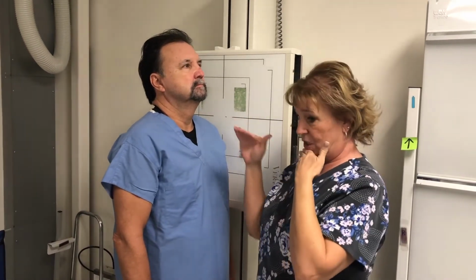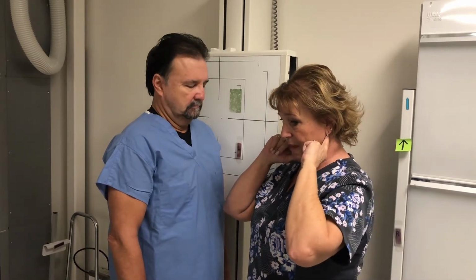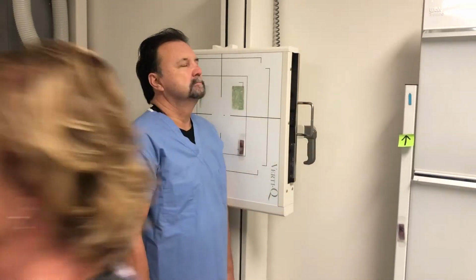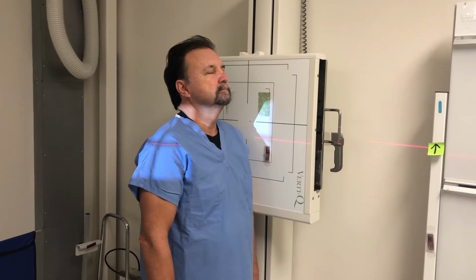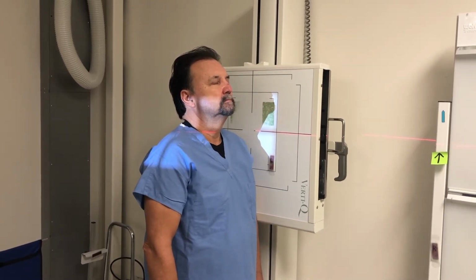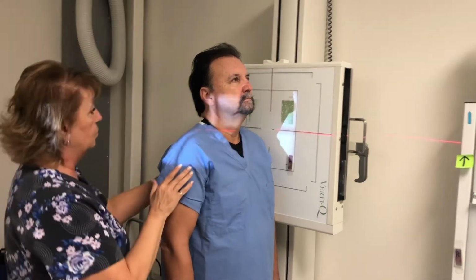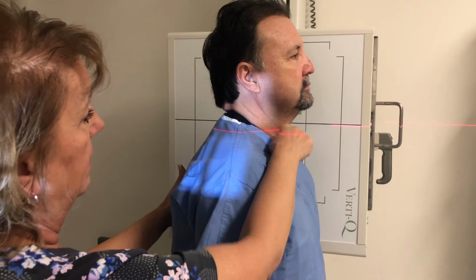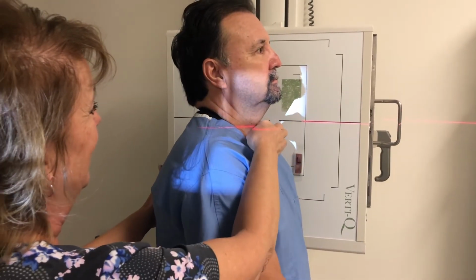If he left his chin down, his mandible would cover that up. So I'm going to have him raise his chin. I raised my bucky, so I'm going to adjust my central ray up, and we're going to be aiming roughly at C4, which again is going to be about the level of his Adam's apple.